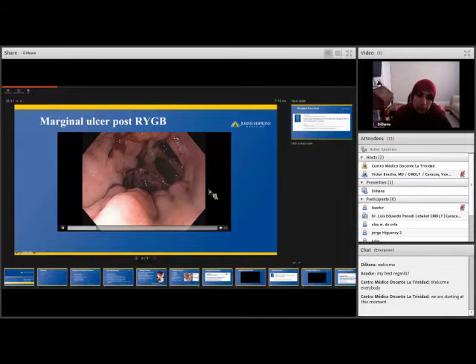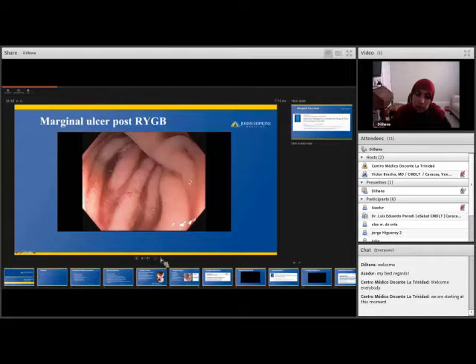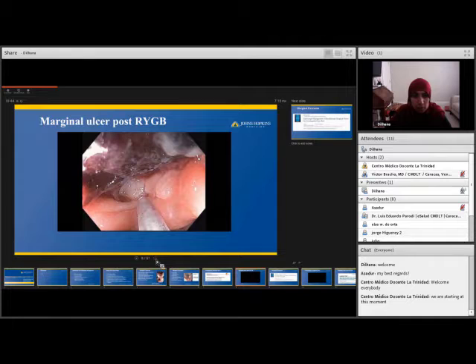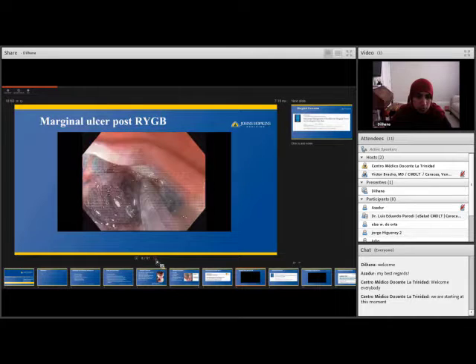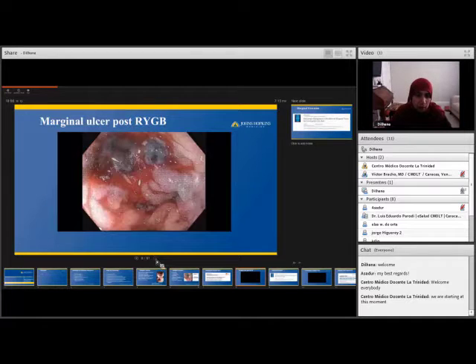And you can see here there's a huge blood clot in the gastric pouch, with evidence of recent but not active bleeding. So you can see that the blood clot is being removed using a Roth net. And then you'll be able to see the ulcer. Once removed, the culprit ulcer was identified, with a large visible vessel on the right. So you can see the ulcer right here, and there's actually a big visible vessel, approximately 6 mm, and it's pulsating.